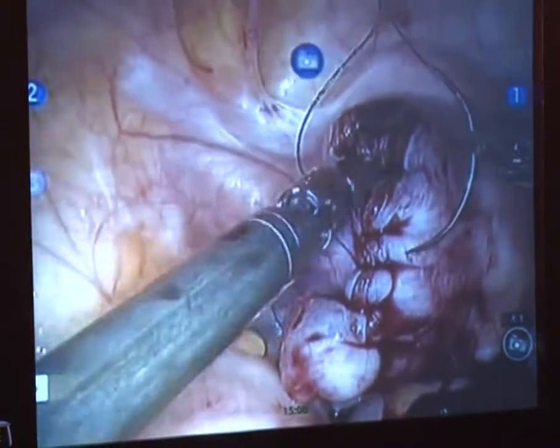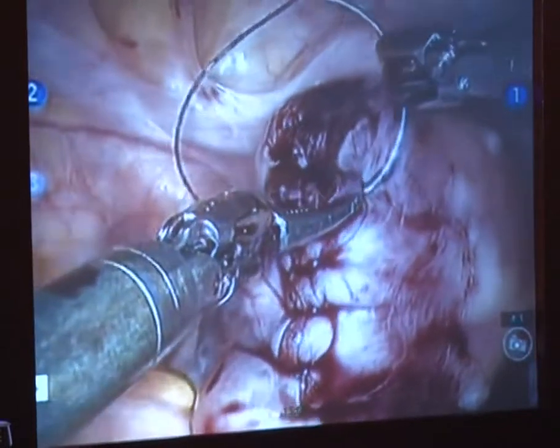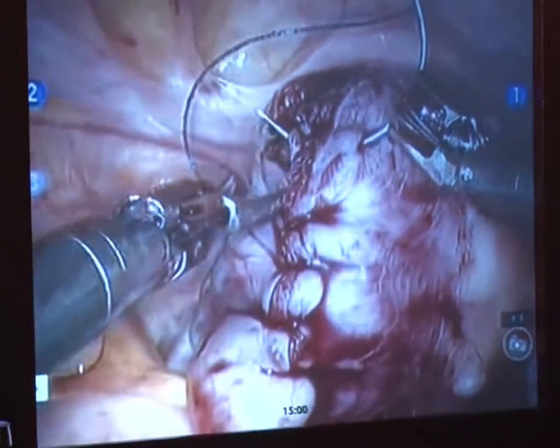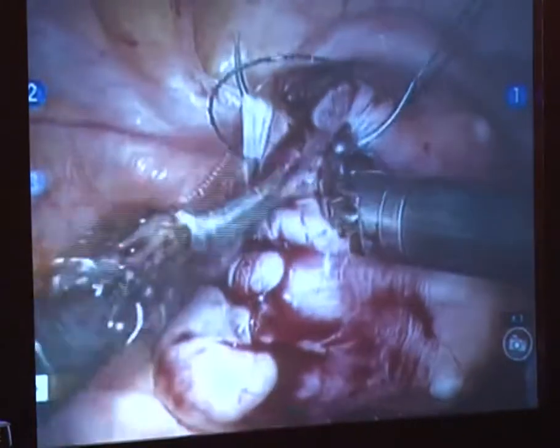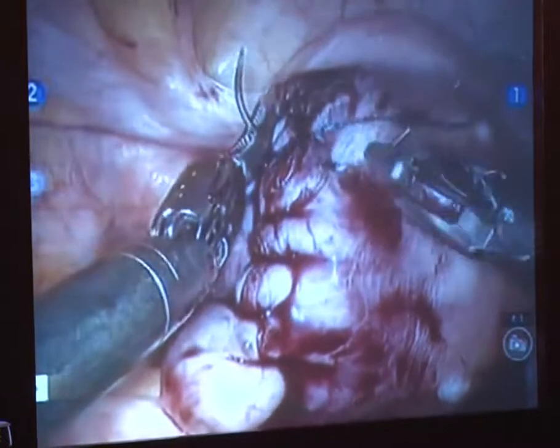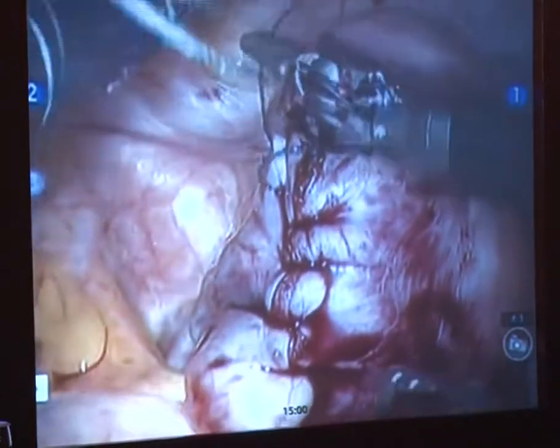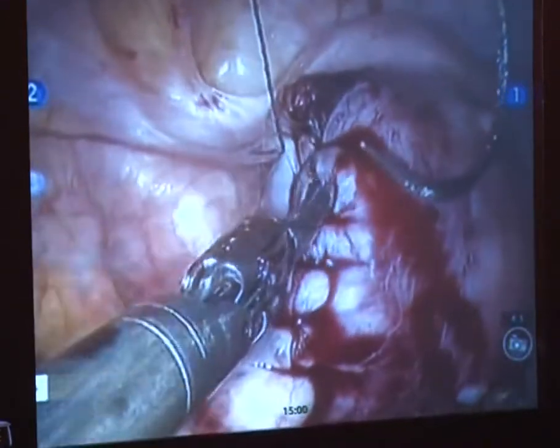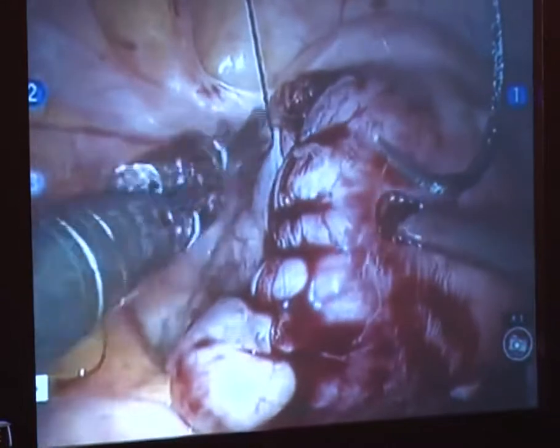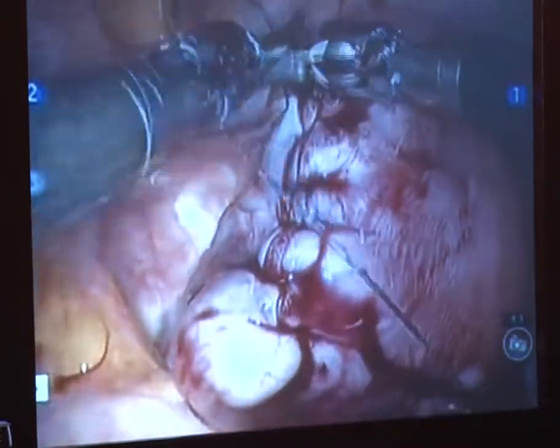Can you suction in here, please? So you can see in a relatively short amount of time, we can enucleate the biggest fibroid and then close it. If there's a bunch of fibroids to remove, I don't like to keep removing all the fibroids and then close at the end. I like to fix each defect as I go along, because that way you don't end up with this oozing during the surgery, you know?